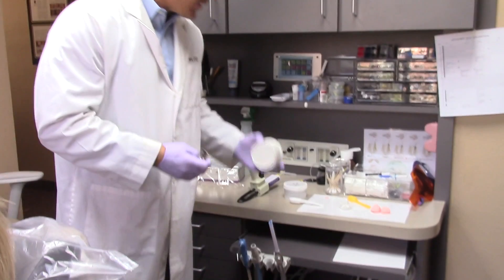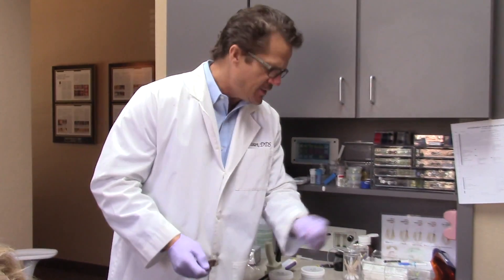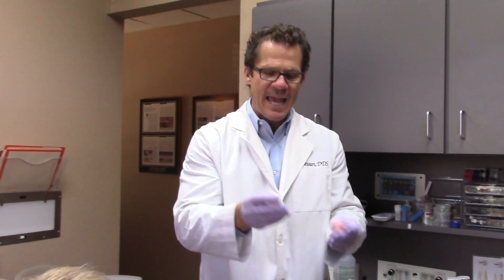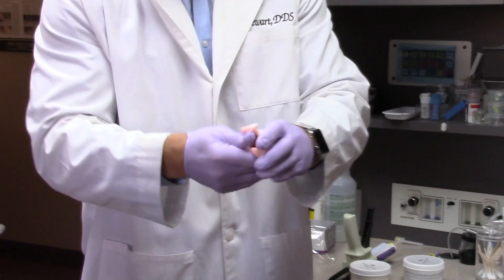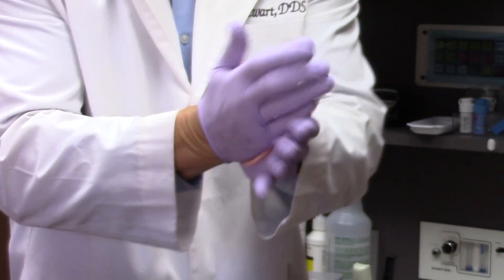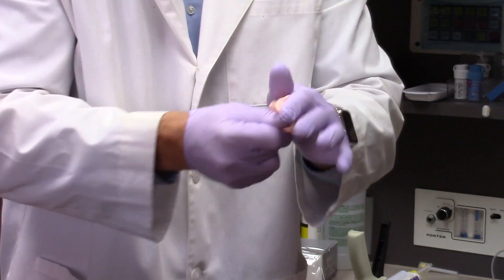They're very easy to take. There's a specific technique that we like to use and I'm going to show that to you now. The first thing we're going to do — I'm using Chromaclone putty and wash. Here's the base and the catalyst. I've got about 20% less catalyst than base, which gives me a little bit more working time. This base and catalyst set up very, very quickly, so we want to only take about 10 or 15 seconds of mixing the base and catalyst so that we have plenty of working time.